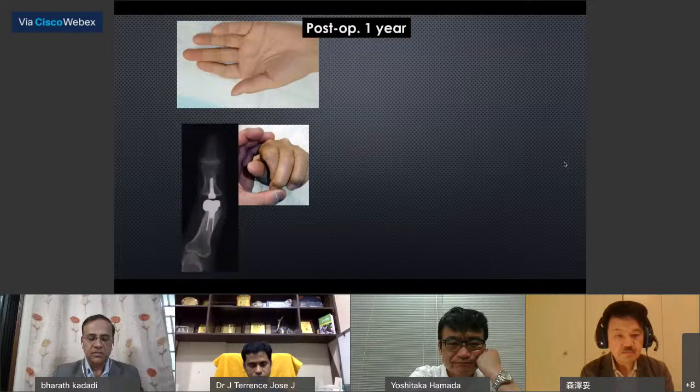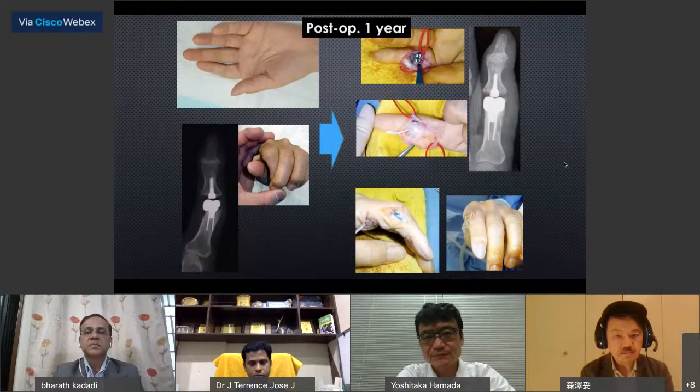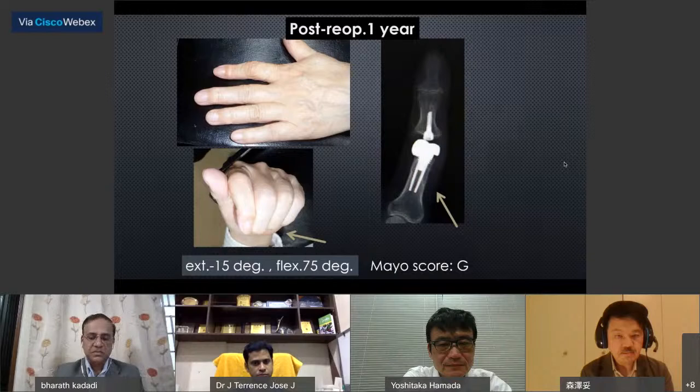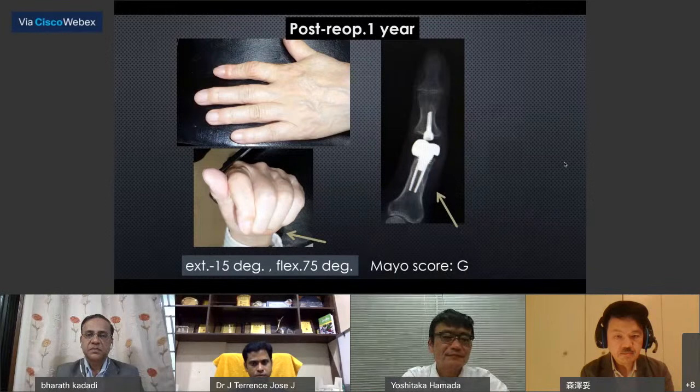So I performed a revision operation, removed the original implant and changed into a larger implant for the proximal phalanx and made realignment with FDS half slip. Post 1 year reoperation, ulnar deviation and instability were improved, and she could pinch and had no pain. Mayo score good.